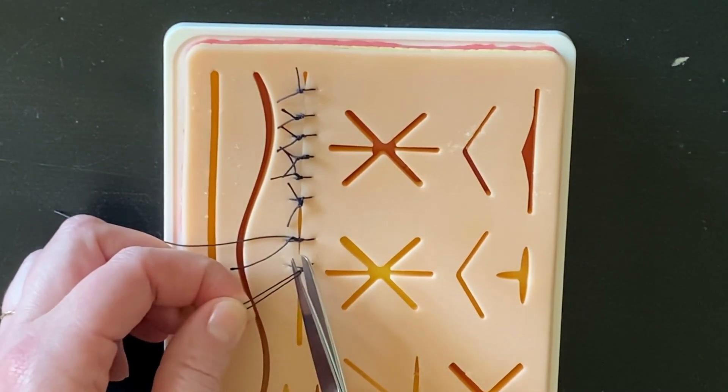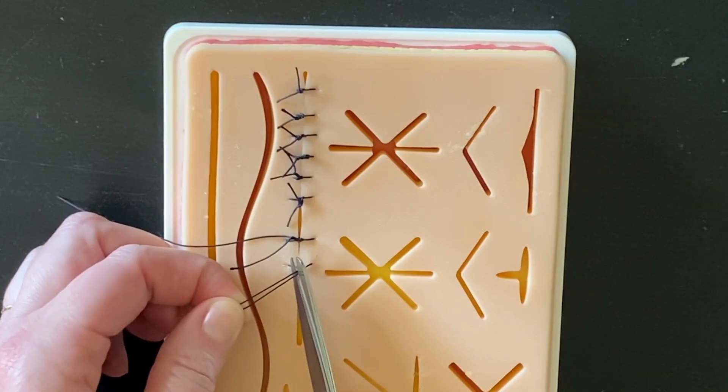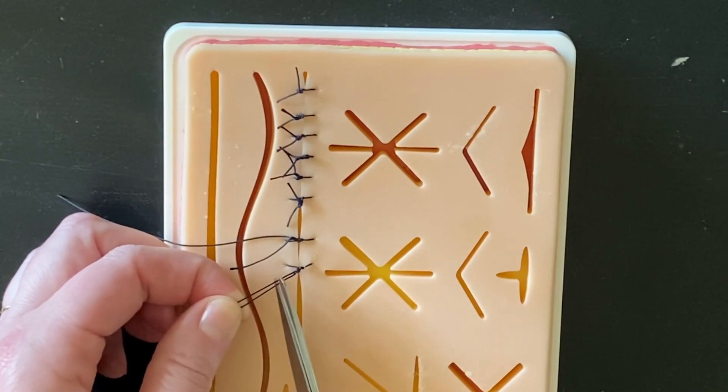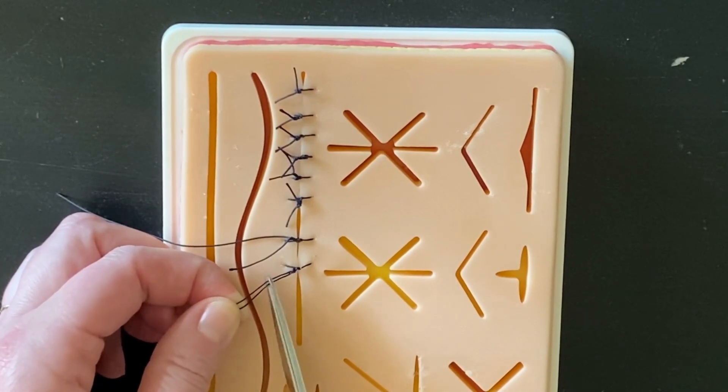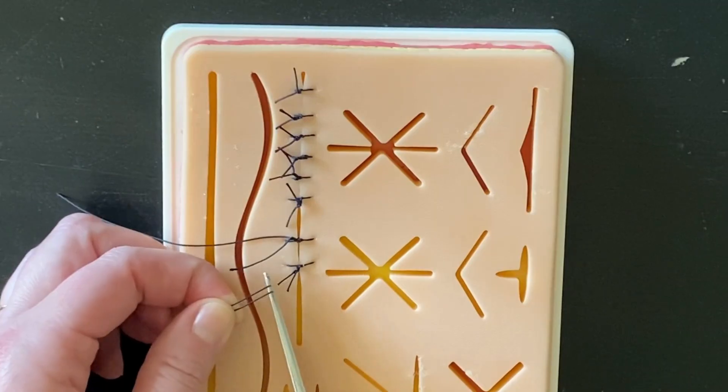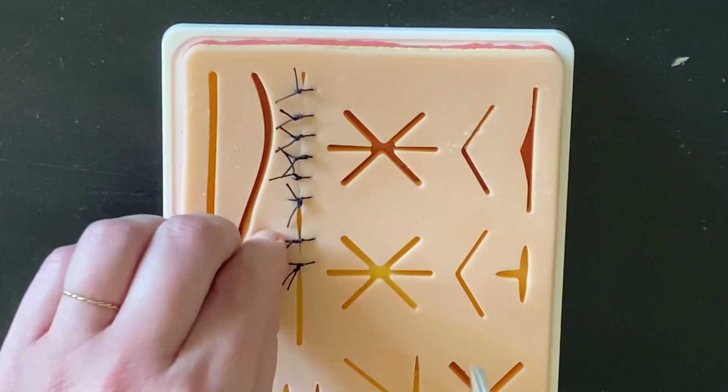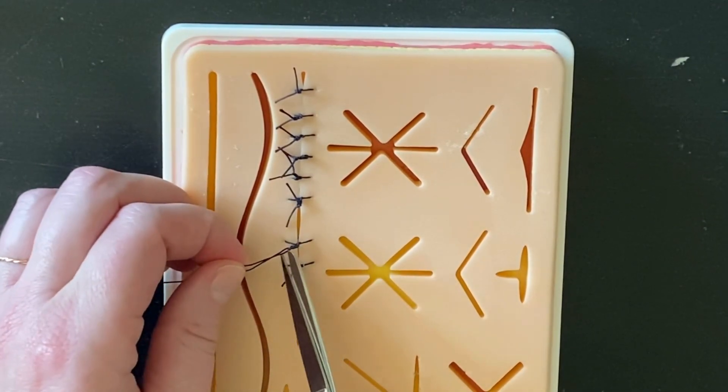You can either go straight down to the knot and cut on the knot. For these longer sutures, you're leaving that tail. So flip the suture around so you can see exactly how long of a tail you're cutting. It's really just a very fine movement.